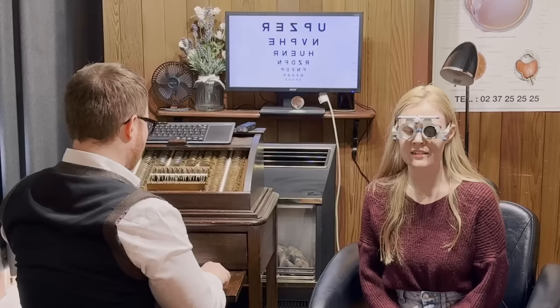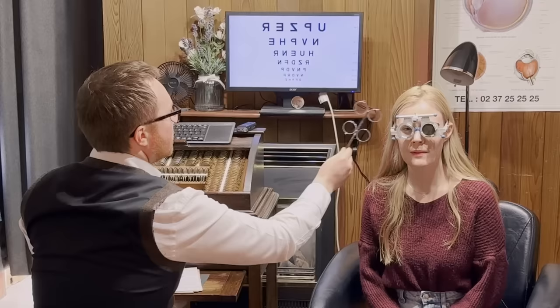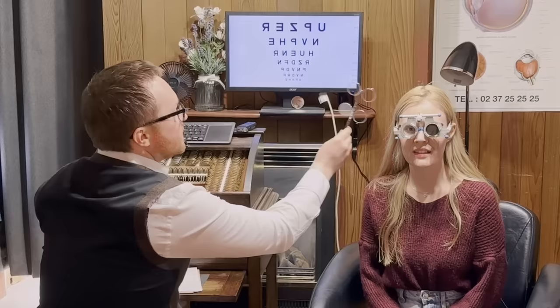Very good. And that bottom, or the bottom two lines, as you're looking at those, are they better with this in front, a little bit worse, or about the same? So that's with, and that's without. Actually slightly better with. Sometimes it takes a second or two to come into focus. Oh, that's so clear. Have a few blinks. Still looking at those bottom two lines, are they better with this one in front, a bit worse, or about the same? So that's with, and that's without. It's worse with.